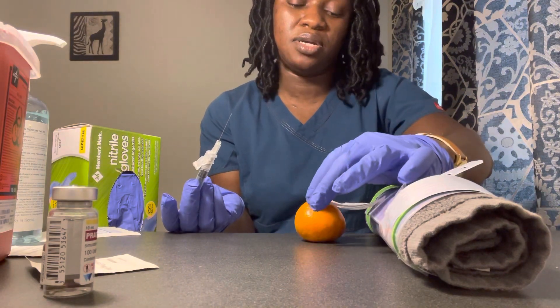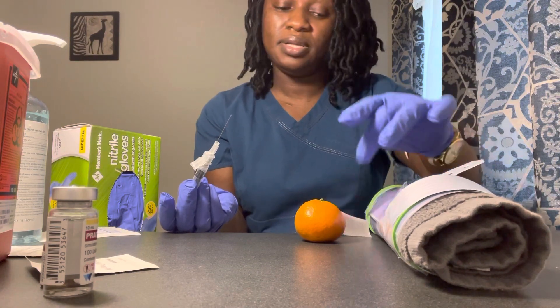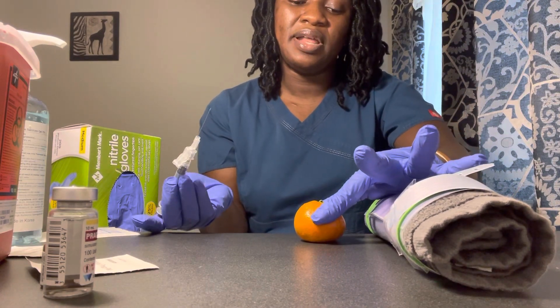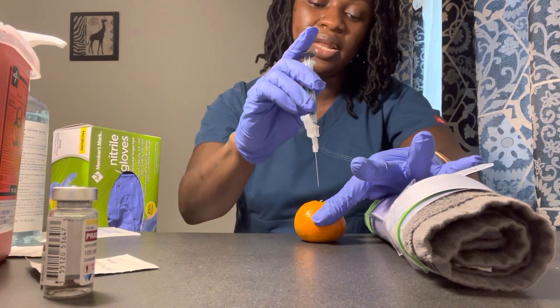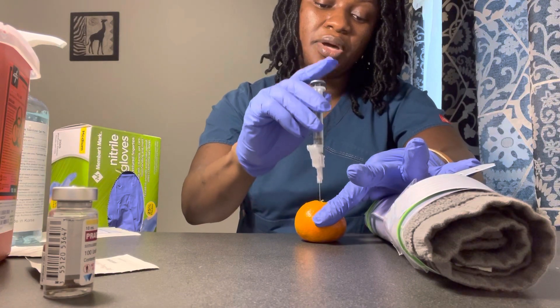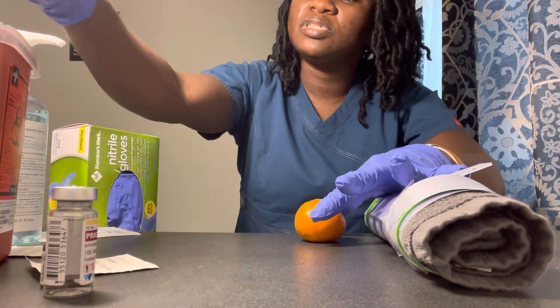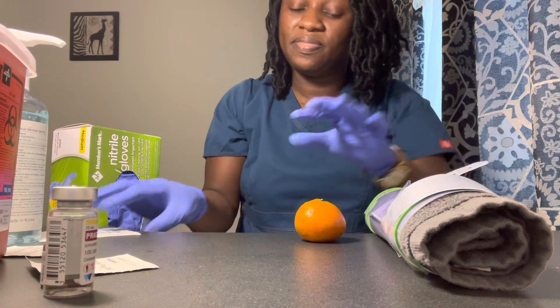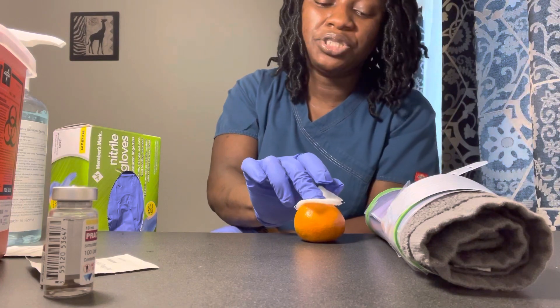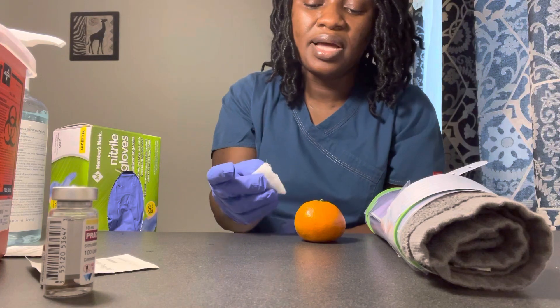When you're ready I'm going to pull the skin and go at a 90 degree angle. I'll pull the skin out and go right in between — you will feel a pinch at 90 degree angle. Coming in. You did great. I will activate the safety device as it goes in the sharps. Just got a little pinch of blood — go ahead and blot that and apply pressure for a second or two. It looks like we are all good.